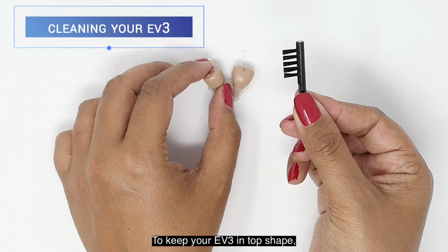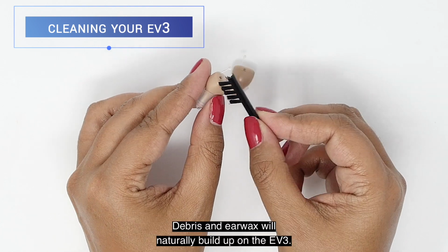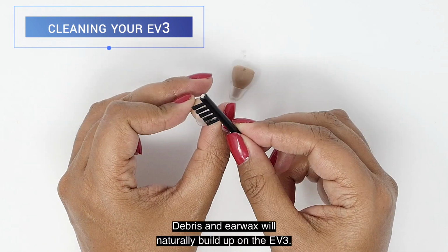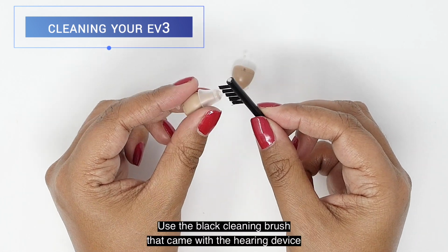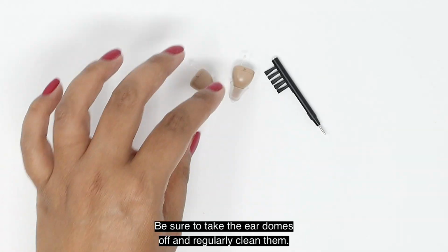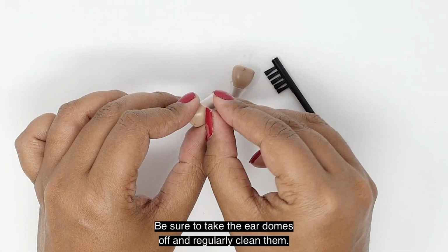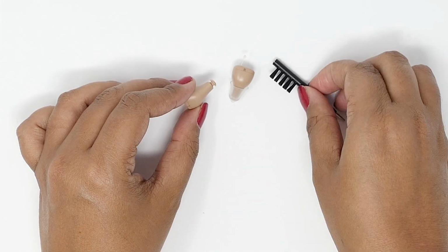To keep your EV3 in top shape, you'll want to keep regular maintenance. Debris and earwax will naturally build up on the EV3. Use the black cleaning brush that came with the hearing device to remove debris. Be sure to take the ear domes off and regularly clean them. Regularly charge your device as well.